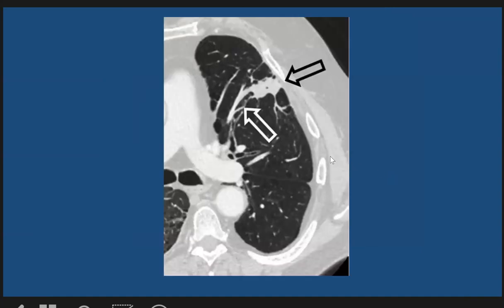Here is round atelactasis in a patient with asbestosis. We see a left lung mass abutting the pleura, with a comet tail of bronchovascular markings extending into the mass — the classic comet tail sign.